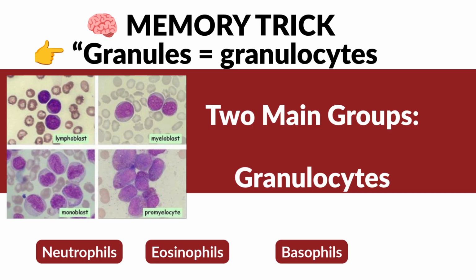Often basophils will be dark blue, often hidden. Think histamines. And one final note you could take from this: granulocytes are central, which means they're central to infections, inflammation, leukemia, and interpretation of differential counts. The MLS exam frequently tests morphology and disease association together.